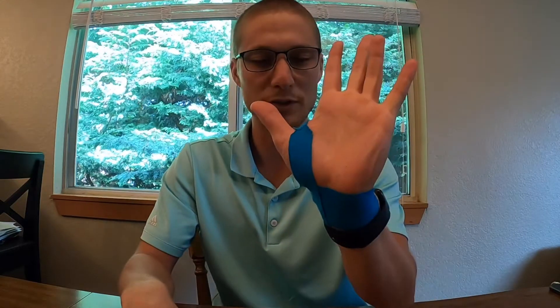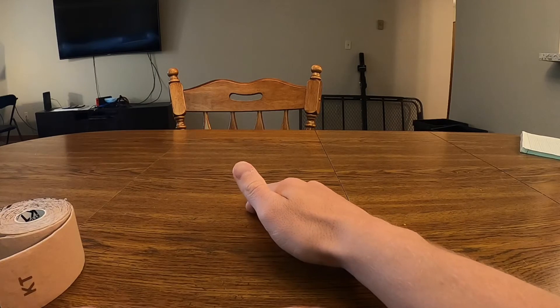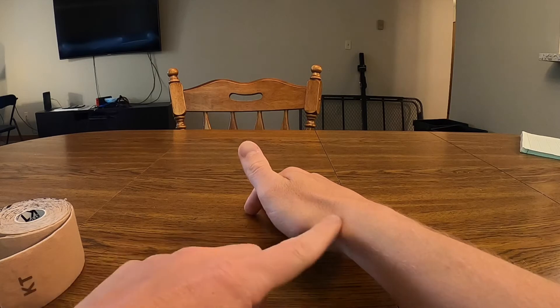If we can tape this along muscles and along joints, it can actually increase function and a lot of times decrease the pain. I'm going to show you — since I already have my left wrist taped — on my right wrist what we're going to do. This is incredibly easy; we only need two pieces of tape.